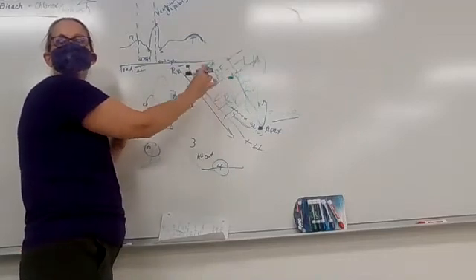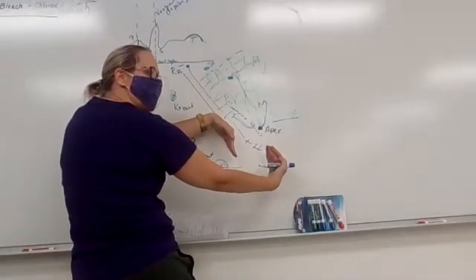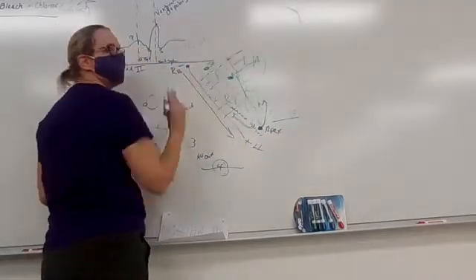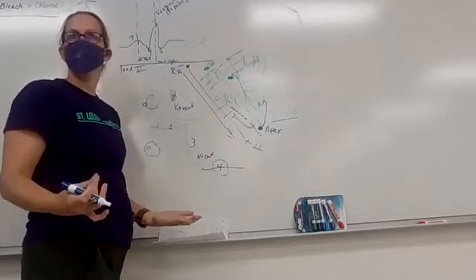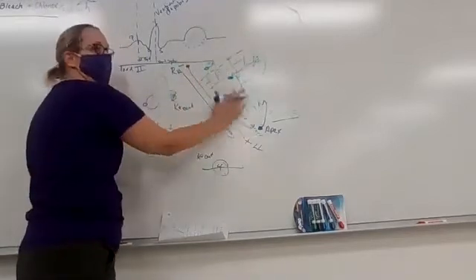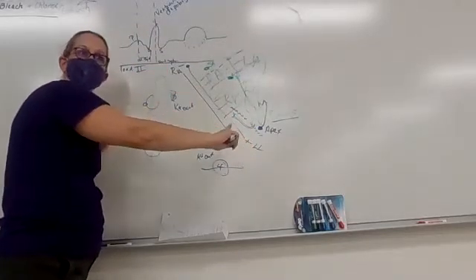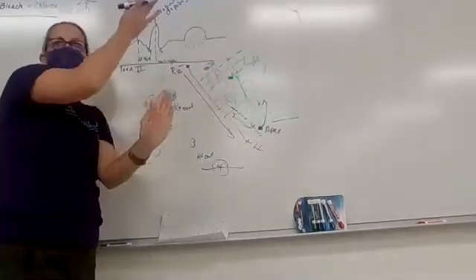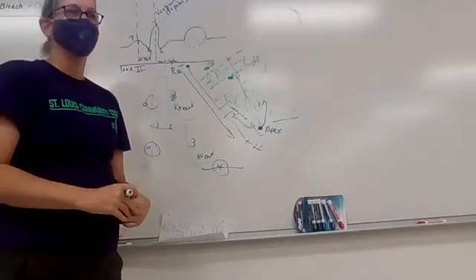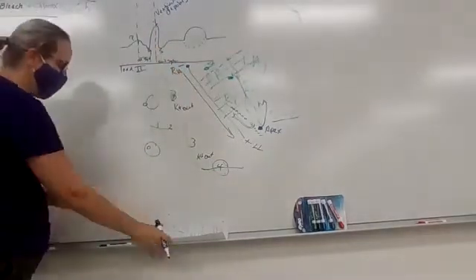So the electrical change that I'm seeing, I'm measuring this way, and the electrical change is occurring from negative to positive this way. So instead of showing a T wave like this, because it's repolarizing and more negative membrane potentials are happening, I see this because what was the direction I'm measuring? Right arm to left leg. What was the repolarization happening? Left leg to right arm, so it inverts. And hopefully that is clear to my Tuesday group, which we had a good discussion, and I was probably very terrible at explaining that. Okay?